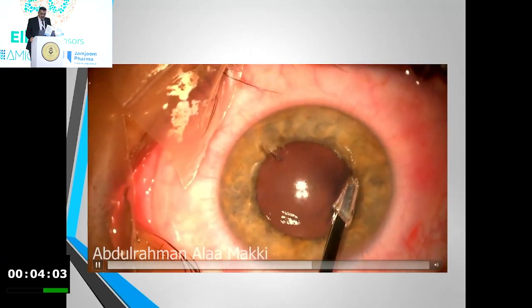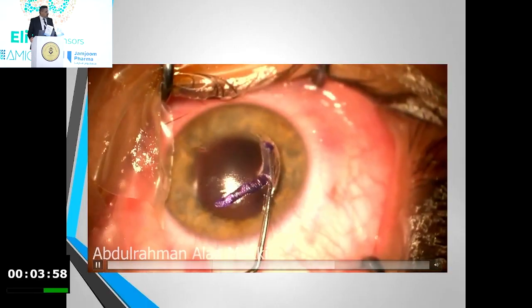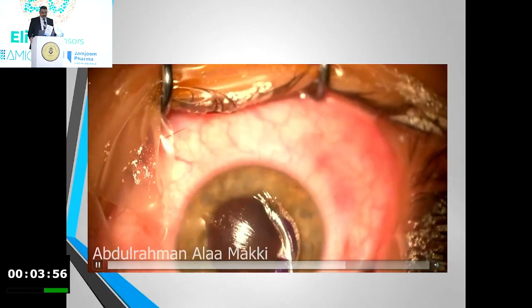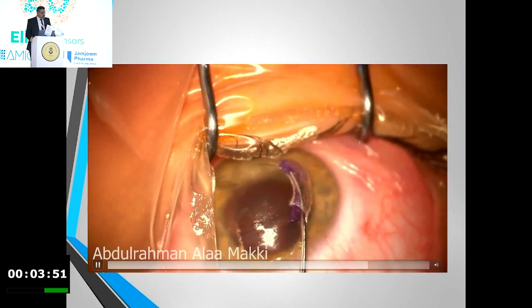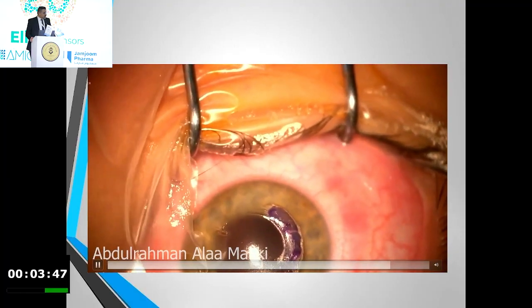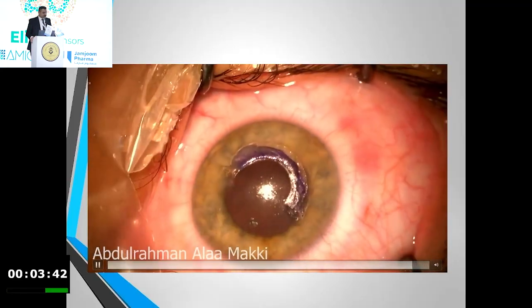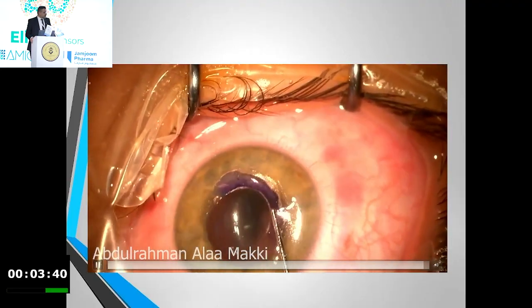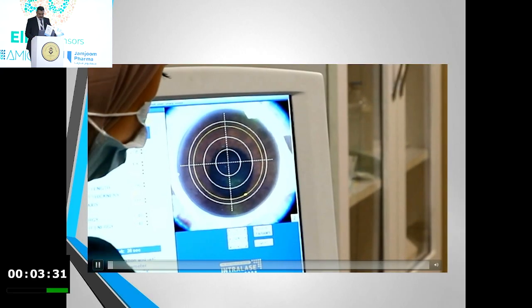I'm introducing the CAIRS segment without drying. It is a bit more difficult than when you dry it, but I am used to inserting it without drying, and I can do this. After that, centration, and I also use marking to know the upper from the lower. After that, massaging. Usually I combine the procedure with cross-linking. At the end of the procedure, I do cross-linking for the patient.